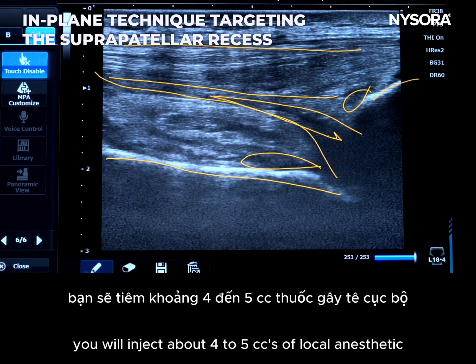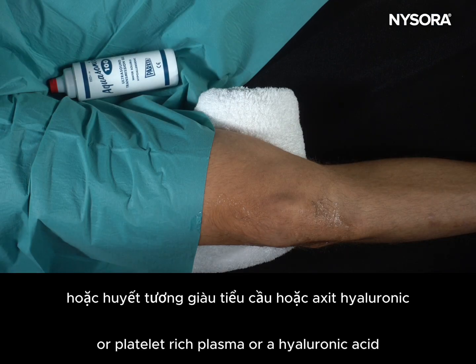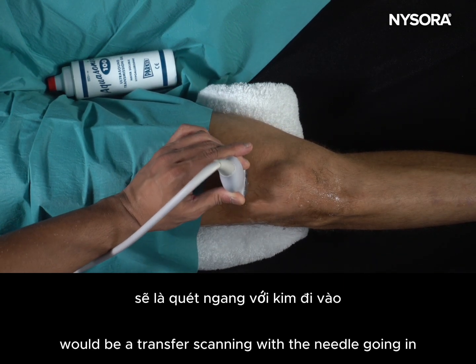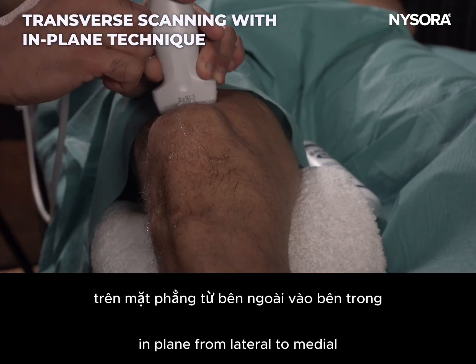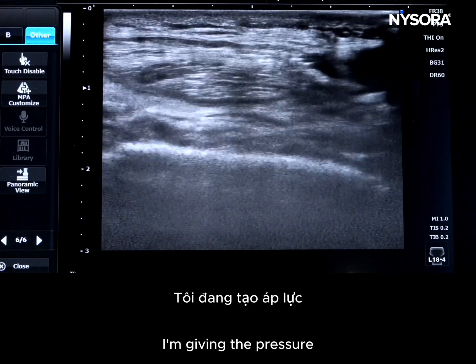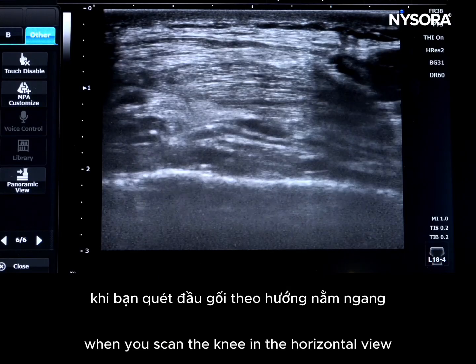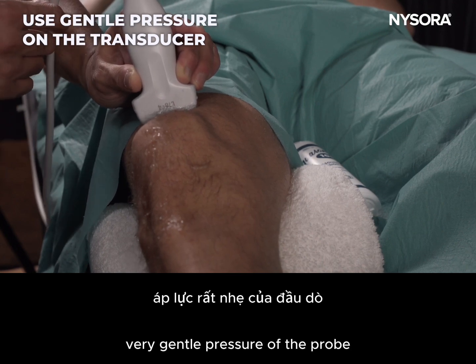You will inject about 4 to 5 cc's of local anesthetic and steroid mixture or platelet-rich plasma or hyaluronic acid. Another technique to perform the knee joint injection would be transverse scanning with the needle going in plane from lateral to medial. In this particular image, as you could see, I'm giving pressure, displacing the fluid from the suprapatellar recess. So the tip here, when you scan the knee in the horizontal view, you have to scan with very, very gentle pressure of the probe.